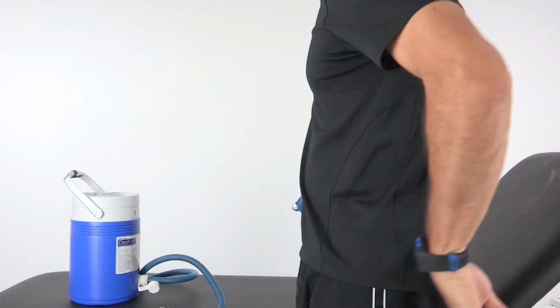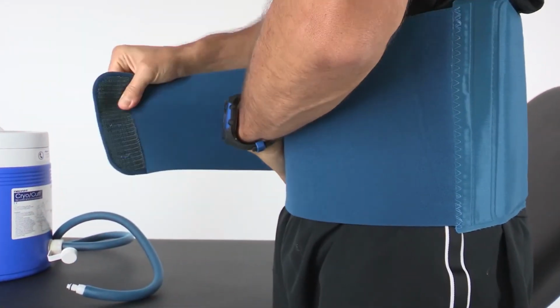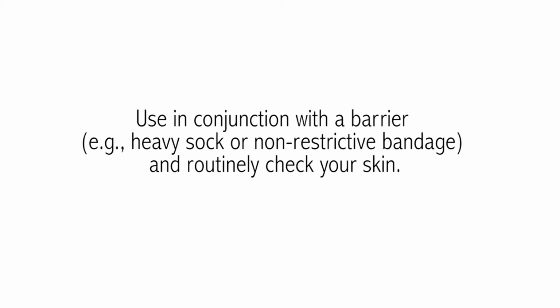Back, hip, rib application. Make sure your cuff is empty prior to application. Apply the cuff over the injured area so that the Aircast logo is upright and facing outward. Ankle application. Make sure your cuff is empty prior to application. Use in conjunction with a barrier.